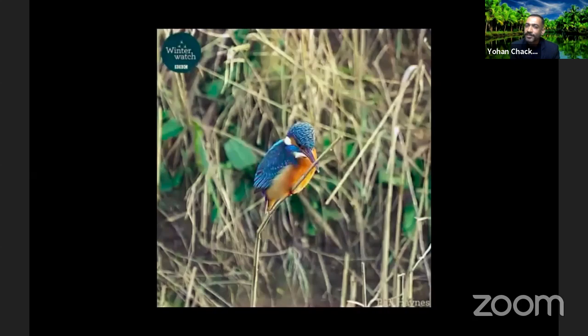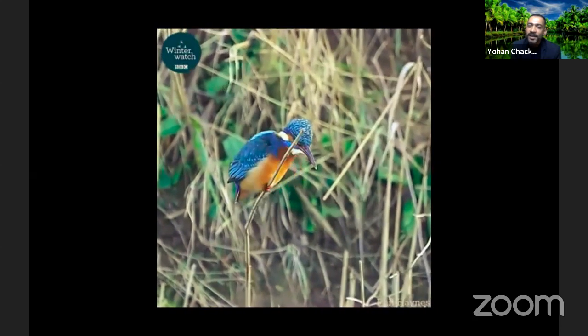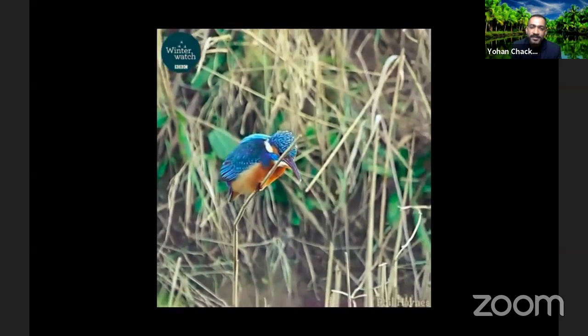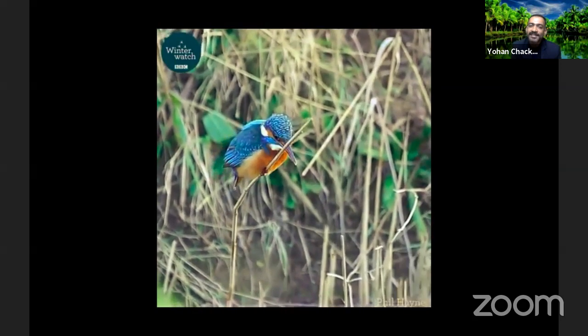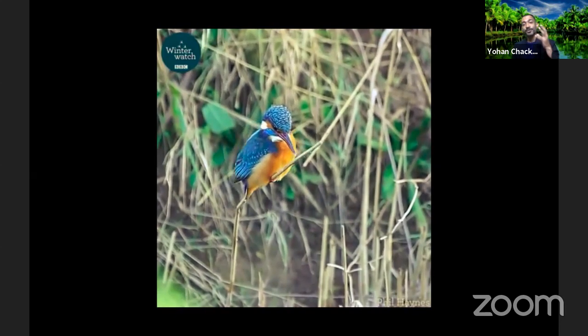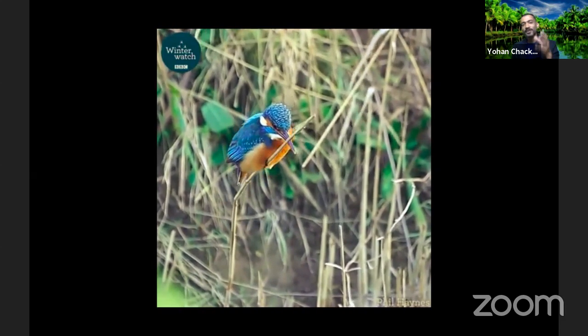So this is a video that a friend of mine from Chennai posted on our endo group. And I told her that, listen, I would be using your video. It's from BBC, and it's the video of a Kingfisher. And I think this is the kind of attention that we need when we are light curing. Despite the wind, despite the movement of the branch, look at the steadiness of that head of the Kingfisher. That is what you should be aiming for when you light cure.